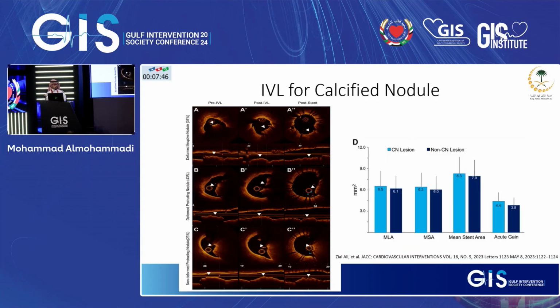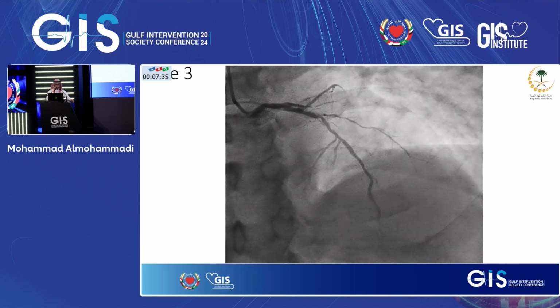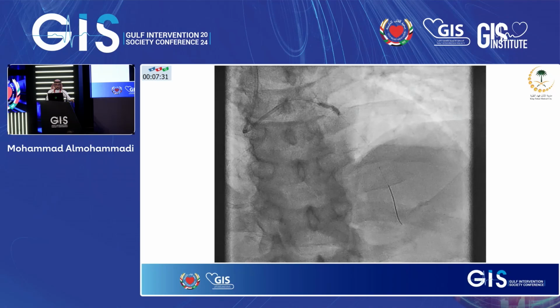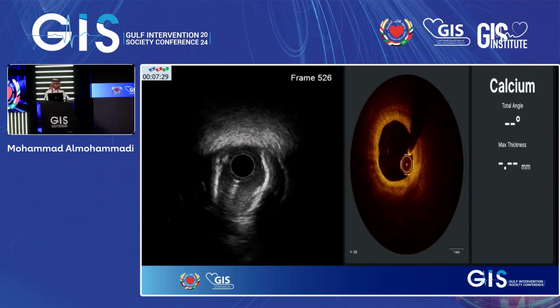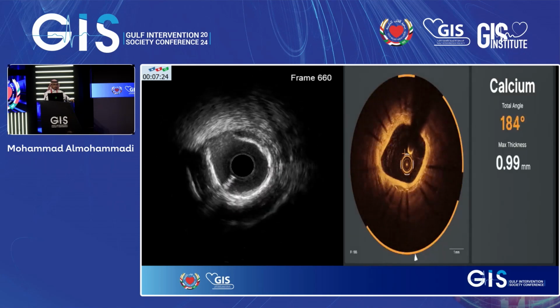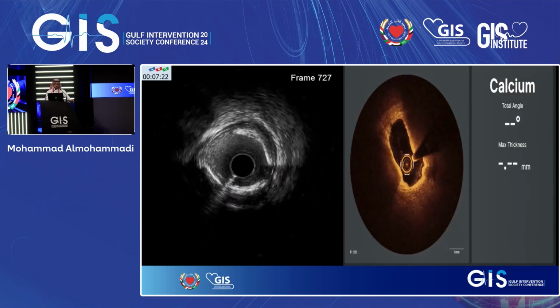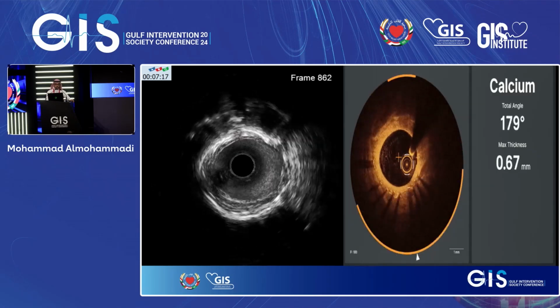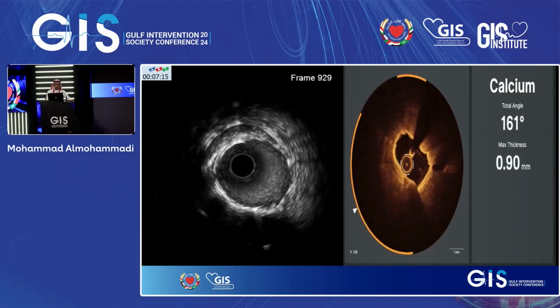This letter came out in 2023 by Dr. Ziad and his group talking about the safety of the IVL. After I read this letter, I said, okay, let's try and use it. So we have this case with a mid-LAD calcified nodule, and we were feeling academic in the cath lab, so we did both IVUS and OCT. I'm going to show you the still images afterward, but we can see here there is some calcified nodule, at least one, present in the mid-LAD.